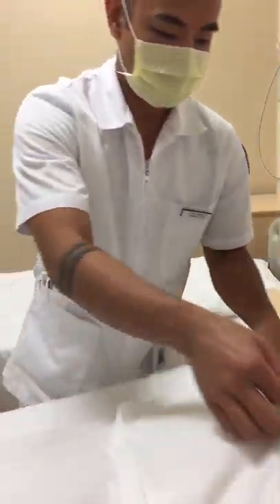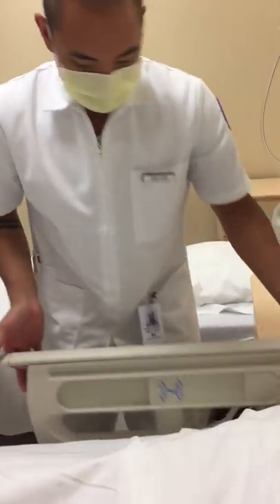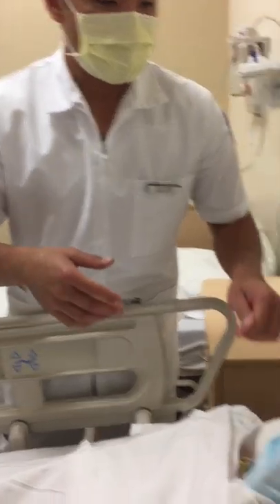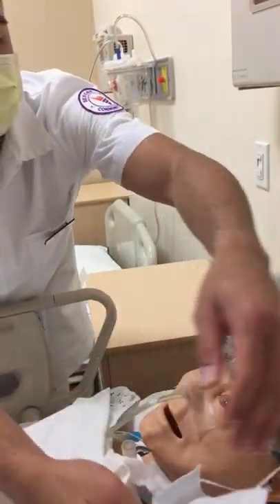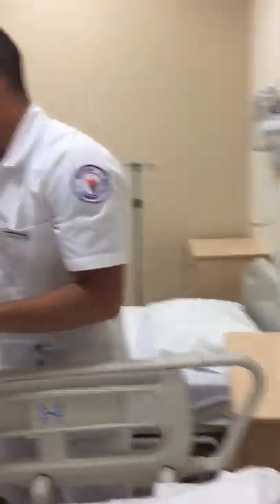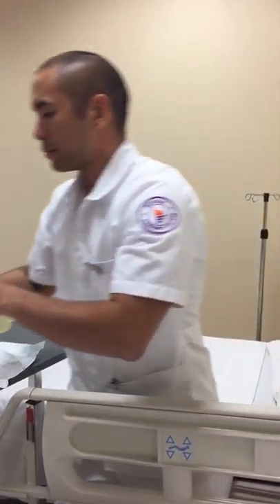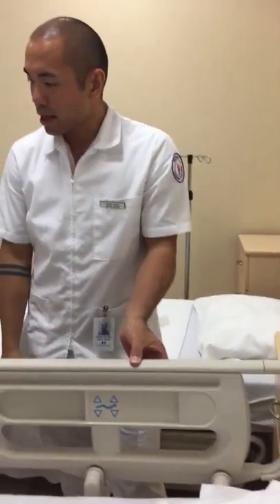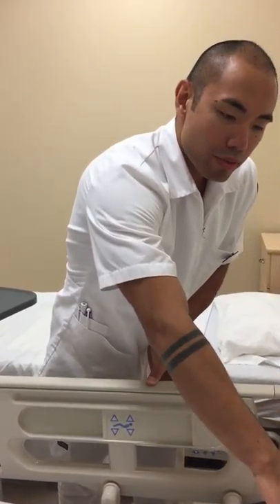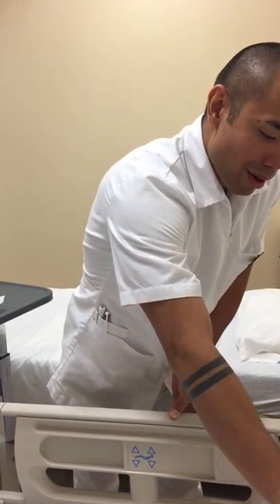I'm going to go ahead and drape him here. For safety, I'm going to lift the arm rail up. Now I'm going to remove his mask, then I'll remove my mask. I'm going to lower the bed to the lowest setting for safety. I'm also going to leave a call bell for him. Mr. Alvarez, if you need anything, please feel free to give me a buzz — I'll be right back. Don't hesitate to call.